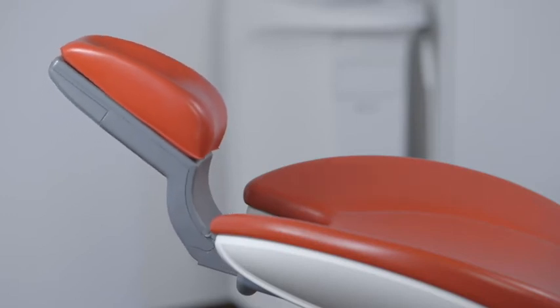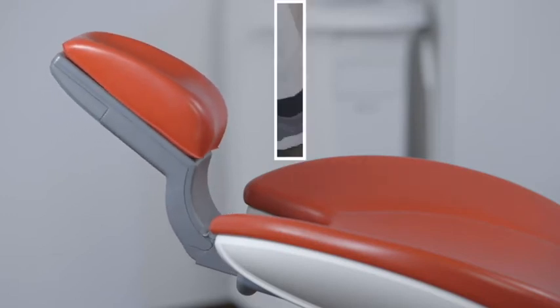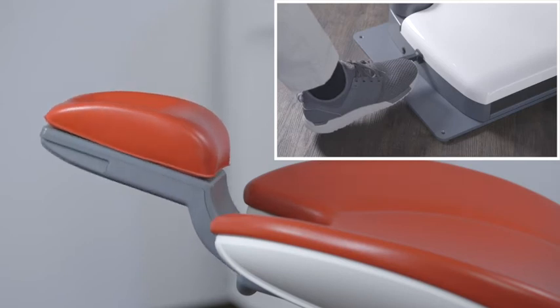The preset head position can be readjusted with the motorized headrest at any time and with no effort.